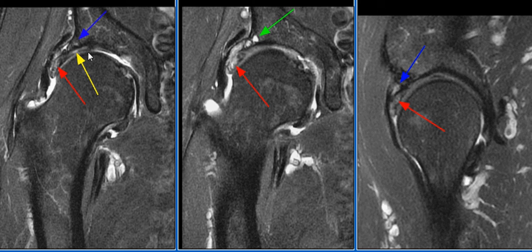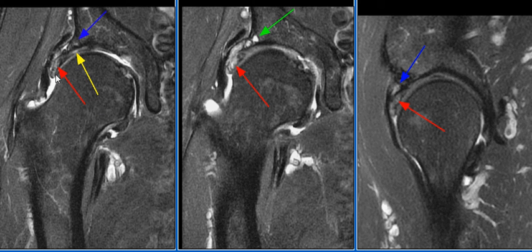Deep chondral fissuring with areas of cartilage delamination are present along the lateral acetabular roof. There is asphericity of the femoral head-neck junction, compatible with femoroacetabular impingement in the setting of developmental dysplasia of the hip.